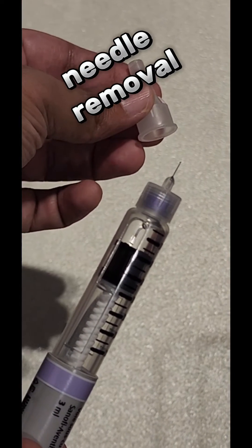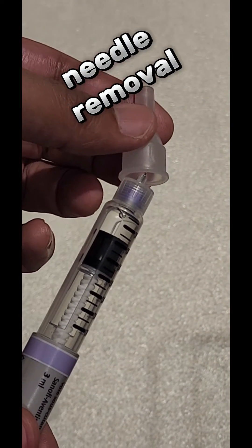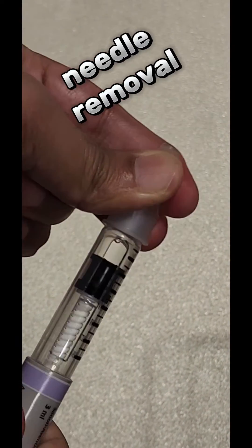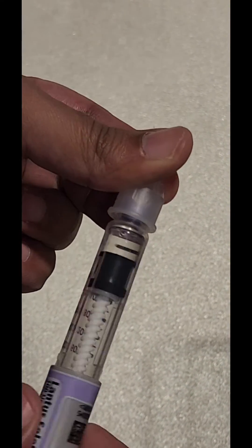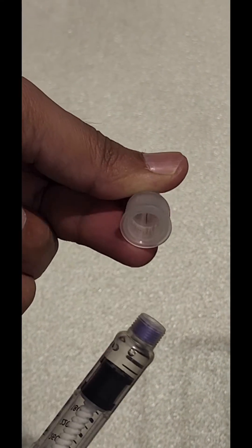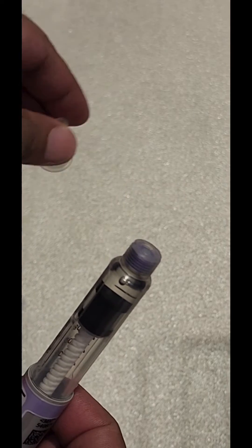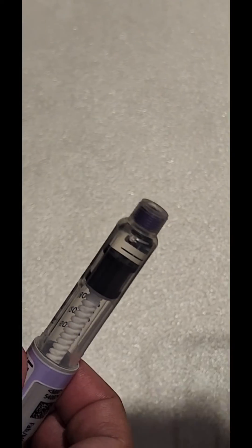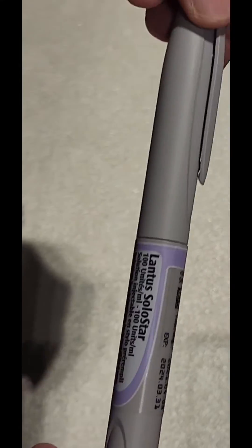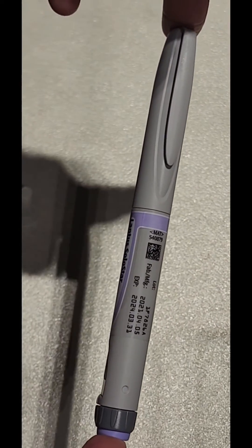Removal of the needle requires the bigger cap that we initially used — simply put it back where the insulin needle is. Be careful not to prick your finger, and unscrew the top bit by removing the needle with the big cap. Once it has been removed, you can place the cap on top of the insulin pen again and store it back in the refrigerator for the next dose. Ensure you use a new needle every time.